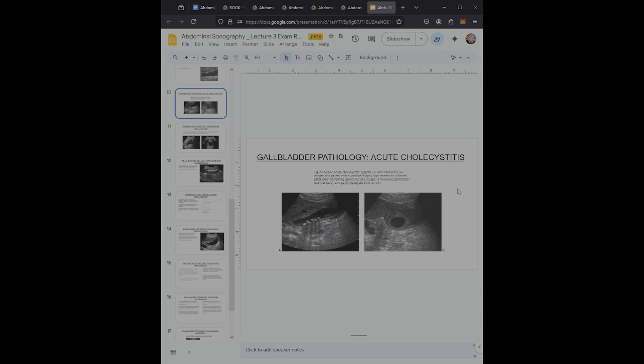Besides patients presenting with right upper quadrant pain and epigastric pain, patients often complain of focal tenderness over the gallbladder in cases of transducer pressure, when the gallbladder is inflamed, and we term this a positive sonographic Murphy sign.